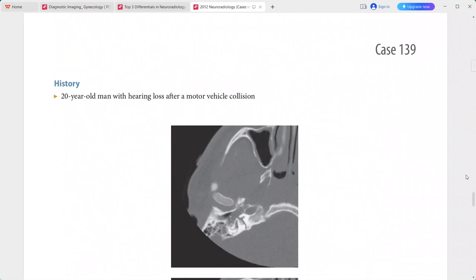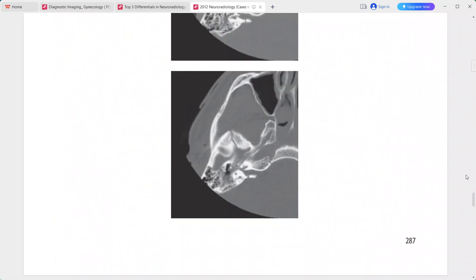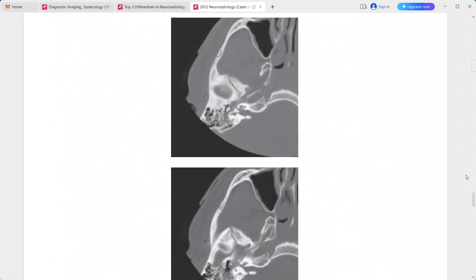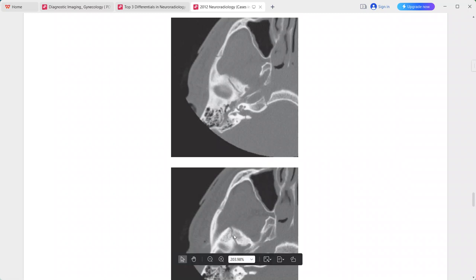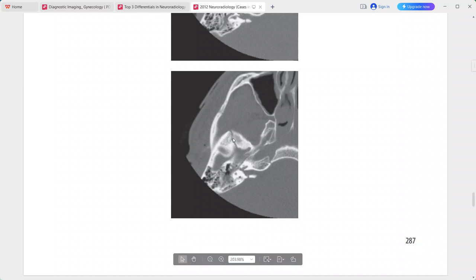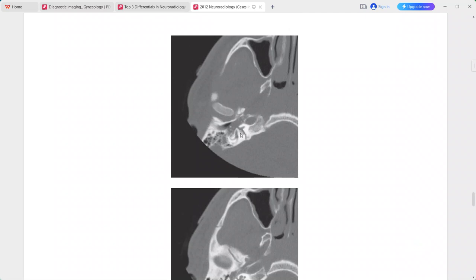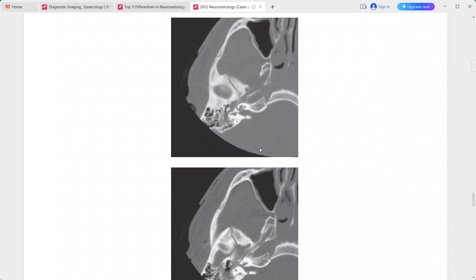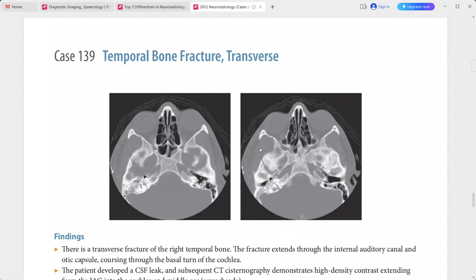A 20-year-old man presenting with hearing loss after a motor vehicle accident. There is a transverse fracture of the right temporal bone extending through the internal auditory canal and coursing through the basal turn of the cochlea. The patient developed a CSF leak, and subsequent CT cisternography shows high-density contrast extending from the internal auditory canal into the cochlea and middle ear.